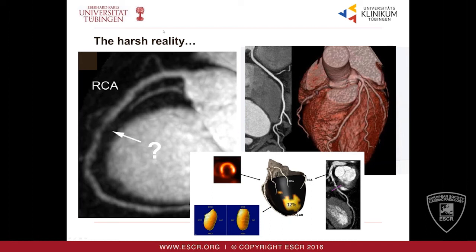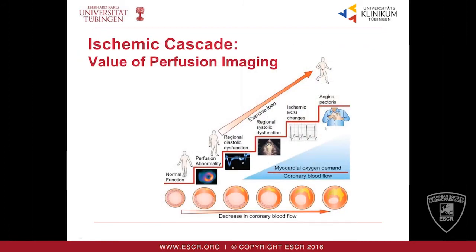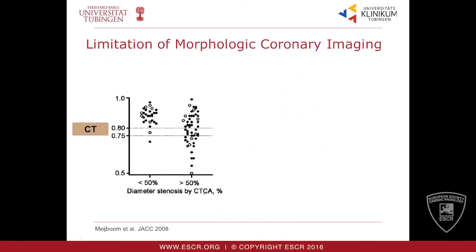So in a perfect world, this would work out nicely, but the problem is that typically MR doesn't make the nice angios, and others can do much better. Let's look at CT or SPECT CT, where you can get morphological imaging or even morphologic and functional imaging in the same investigation. So the reality is that these modalities still are looking for the right place in the diagnostic workup of coronary artery disease.